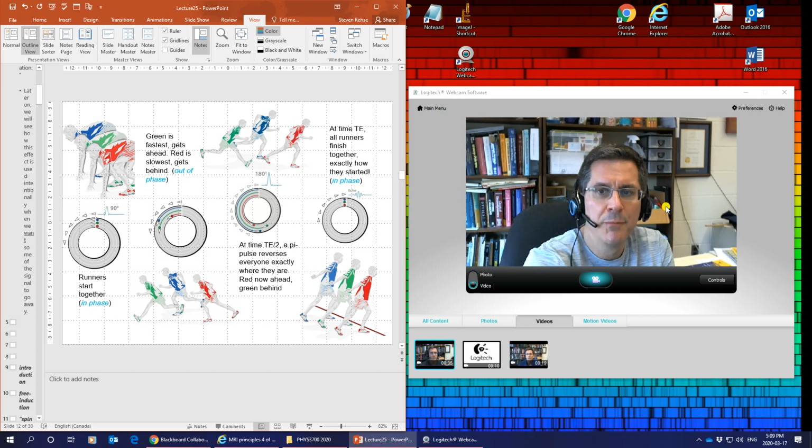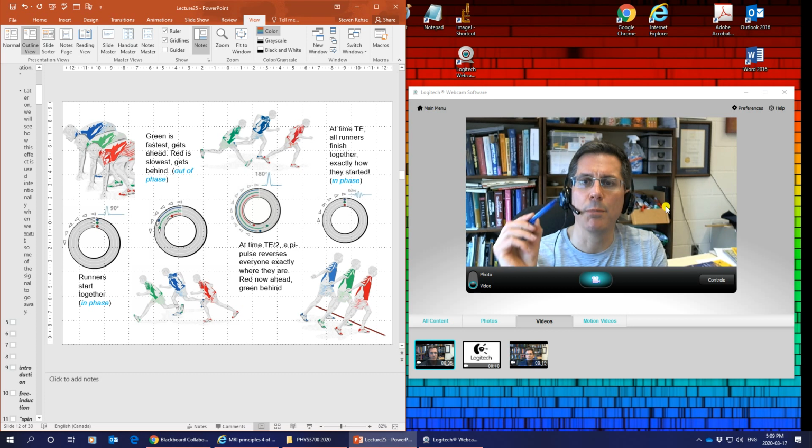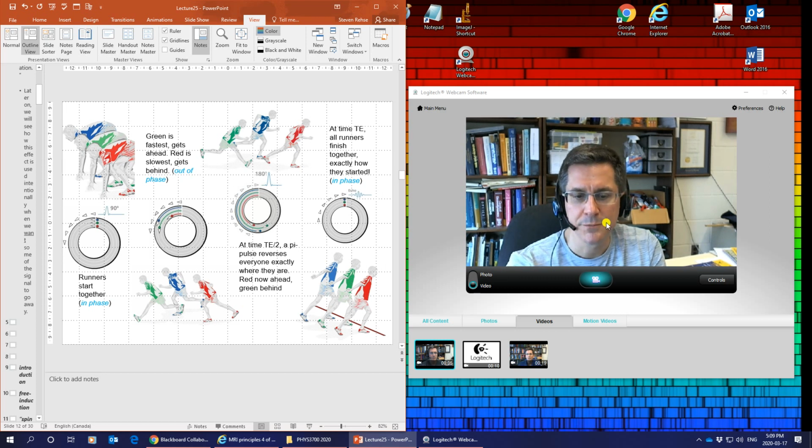So what have we learned so far in this lecture? The pi by 2 pulse rotates the magnetization to the XY plane. Before they have a chance to recover, they get out of phase in the XY plane. You apply a pi pulse, which causes a rephasing, which will then allow us to measure the T2 recovery time.